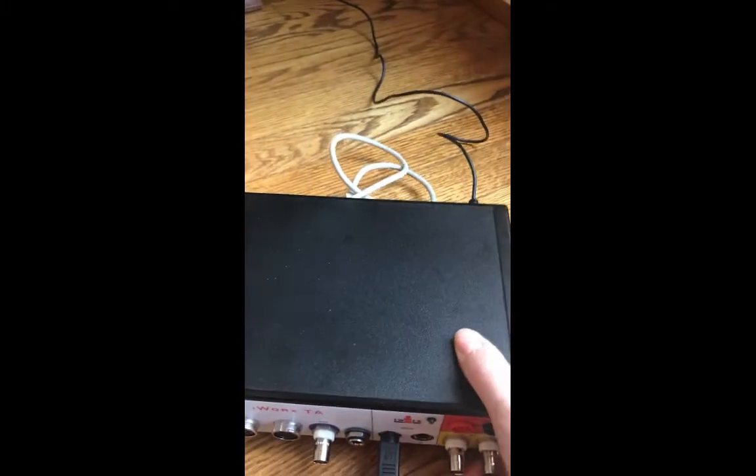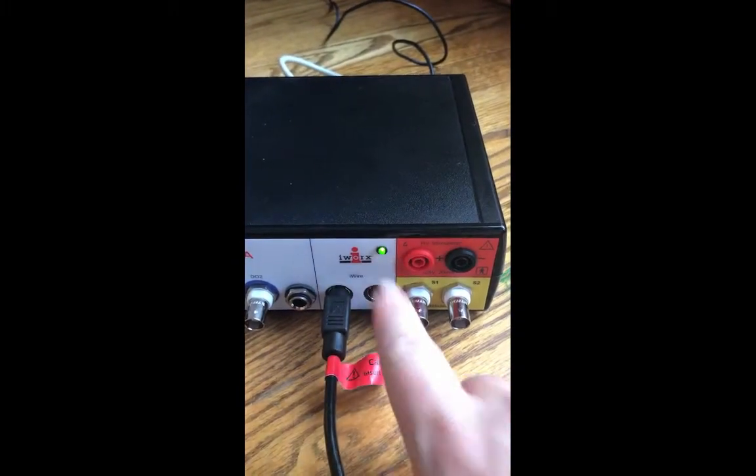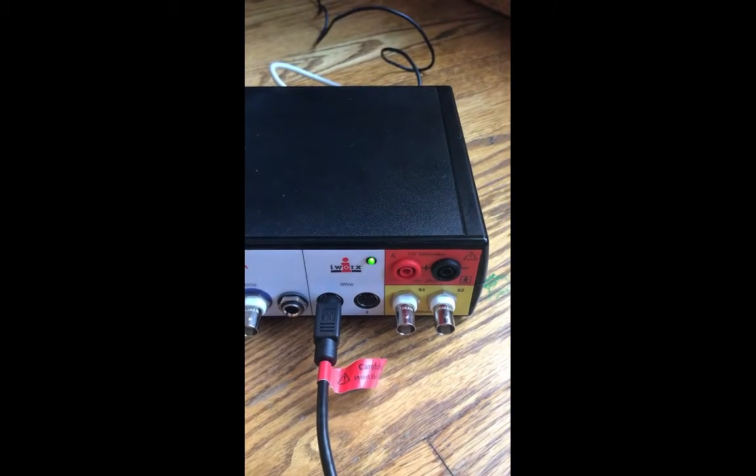After you have everything set up, go ahead and flip your box to the on position. You'll see the little green light in the front come on, which lets you know that your box is getting power.